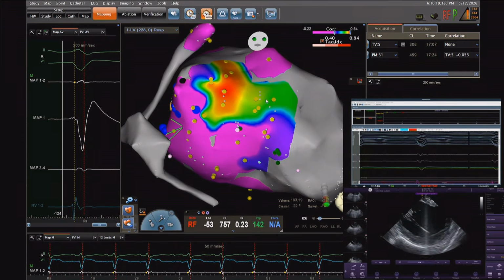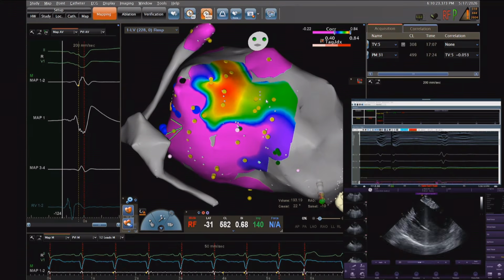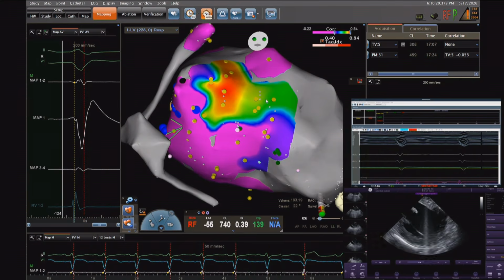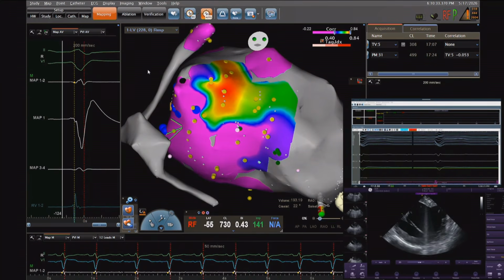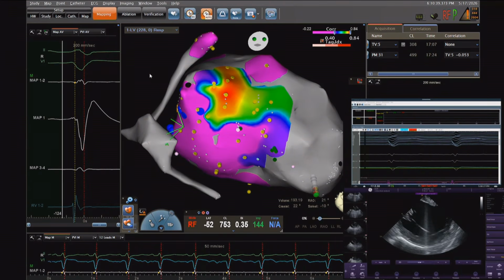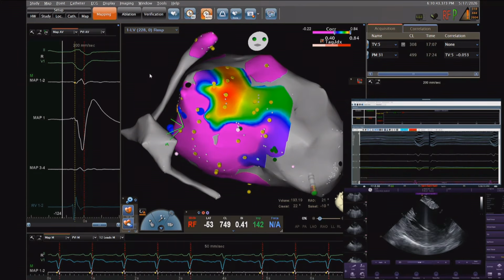I'm just going to remind the audience that what we are seeing right now fits well with one of the scenarios Professor De Cilu stated in his lecture. So the intramural. Yes, the second scenario. If it's intramural septal, yes, that's it. It doesn't look like a simultaneous exit. It's not that narrow, but also it doesn't look very epicardial. I don't know where the origin is, but the exit is not so epicardial because I haven't seen too many epicardial features in the EKG.